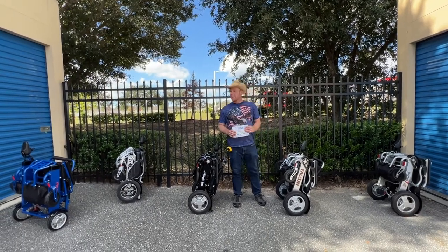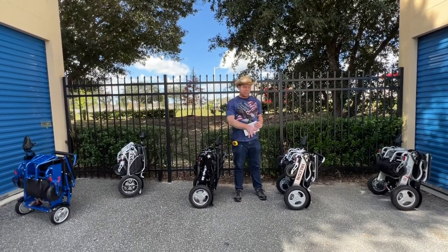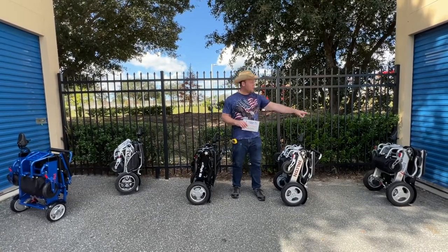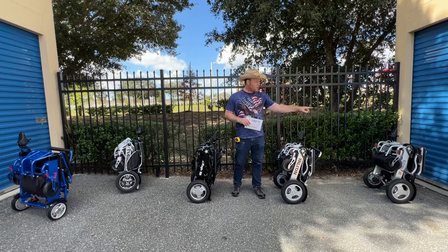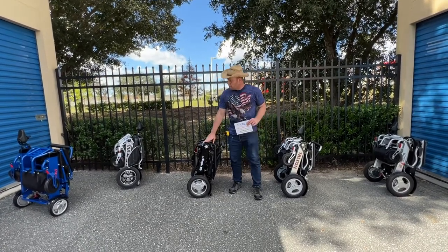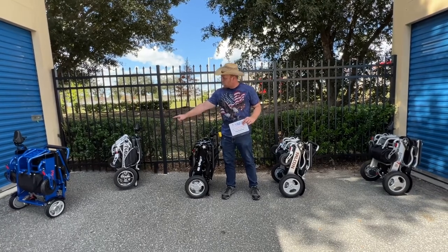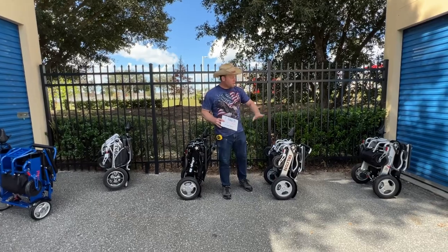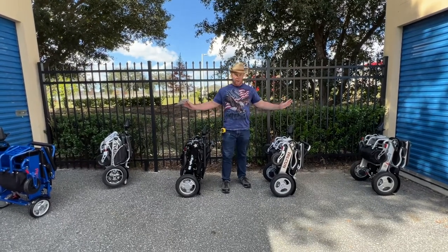Hello, this is Paul from quickenmobile.com and we are doing a buyer's guide video today. We have a lot of questions about the Electra 7, the Falcon, the Eagle, the Evaluation Evolution, and the Phoenix. So in this video we're going to do some very basic comparisons and I'm going to point out some primary differences.